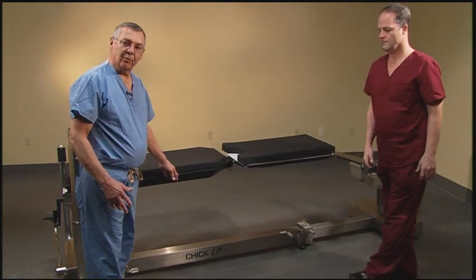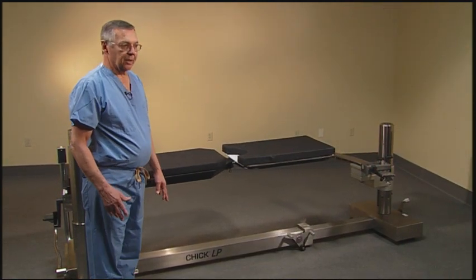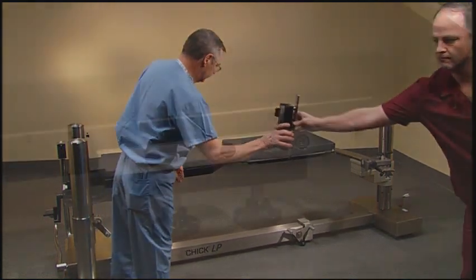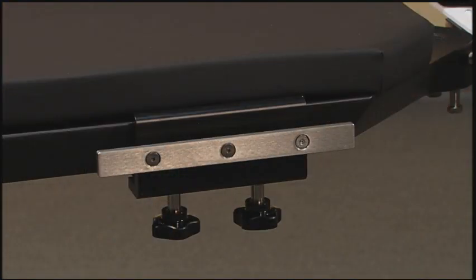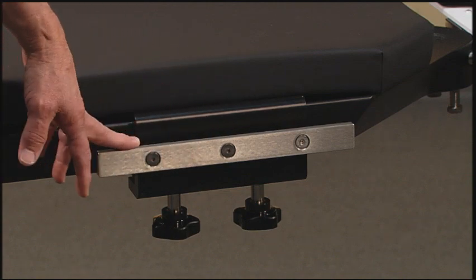Next we will add three removable side rails — one to the operative side and two to the non-operative side. These are standard US side rails, so any arm boards or other side rail attachments will fit on these side rails.